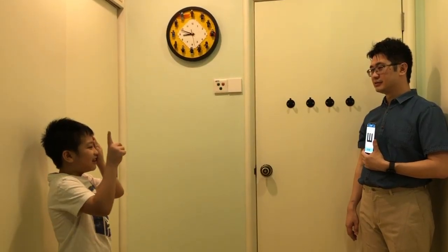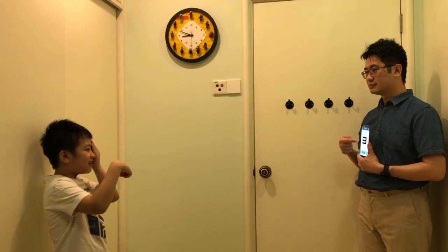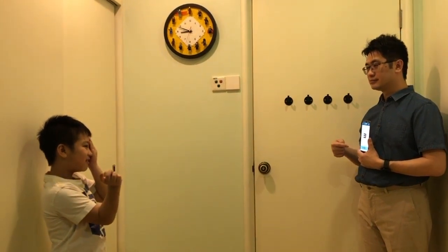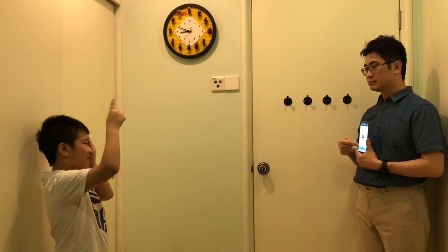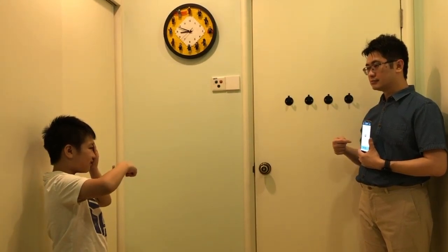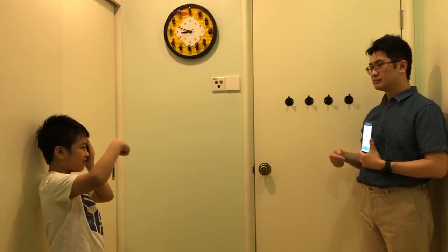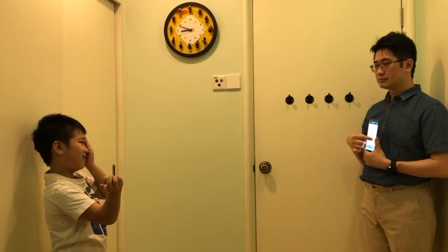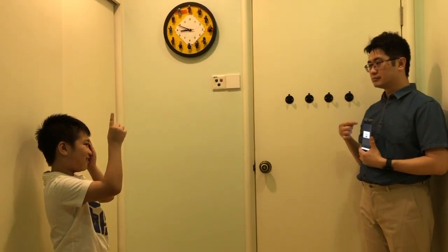This app is so easy to use, even parents can use it on their children at home. Do check your children's vision every now and then, especially during this digital era. The app is available to download for both the Google Play Store and the Apple Store for free.